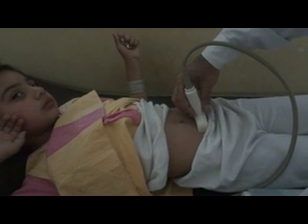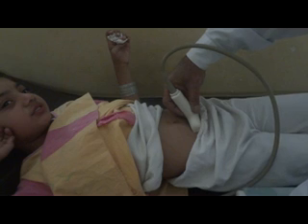When I move the probe anteriorly, I see a cystic area with internal cysts in it. This is the urinary bladder, and this other structure is not relating to the urinary bladder. It is separate from the urinary bladder, in the region of the pelvis.